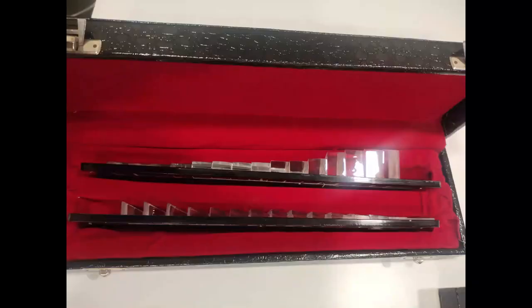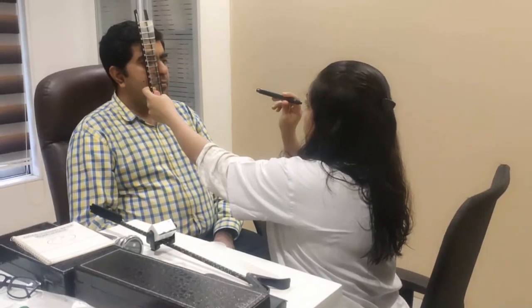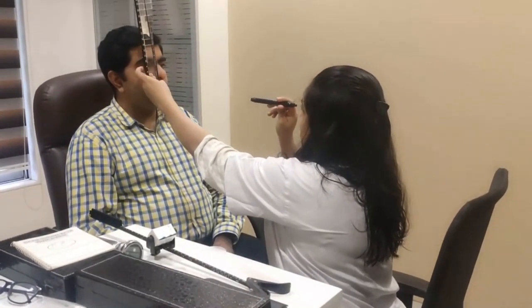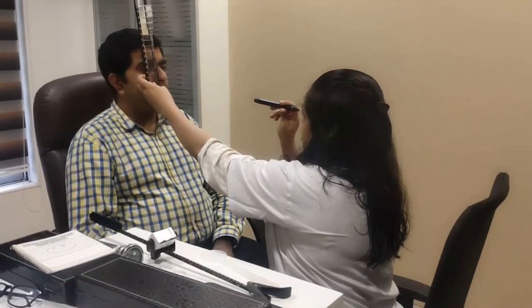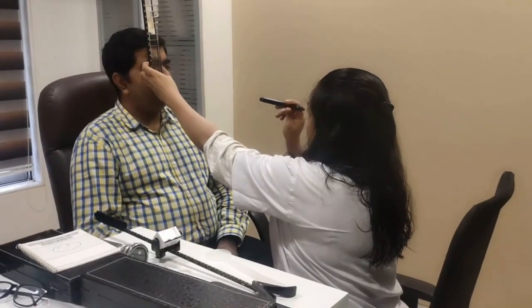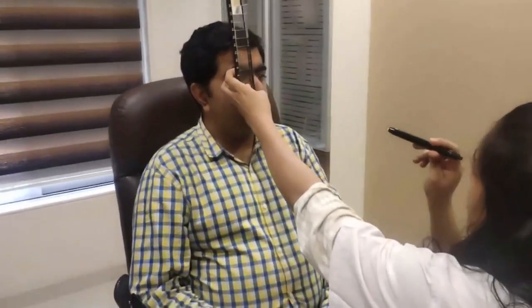The eyes look slightly exotropic for near. On placing prisms with apex towards the deviation at around 6 prism diopters, the reflexes appear to be centered for both the eyes, which shows that the eyes are slightly exotropic for near without glasses.